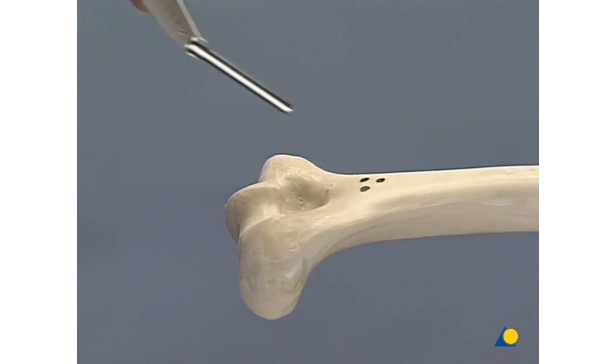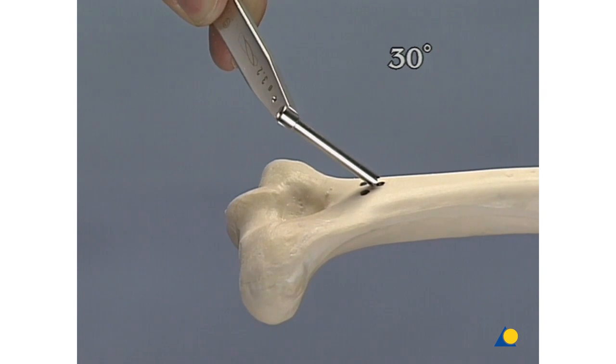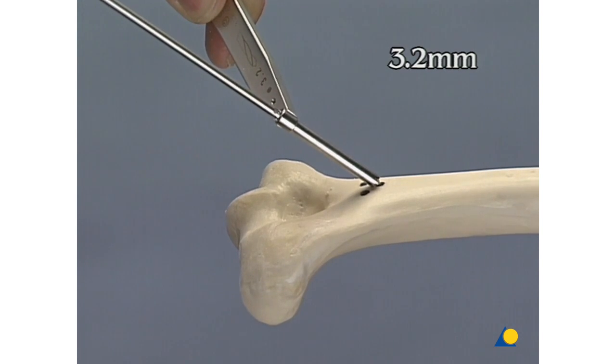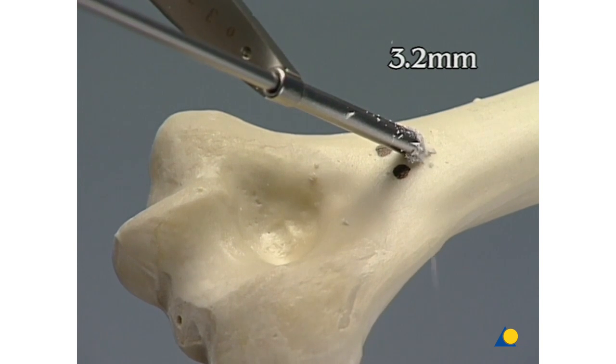The holes are drilled at an angle of 30 degrees. We drill with the 3.2 millimeter drill bit and the corresponding drill sleeve. Be sure to drill only through the near cortex.